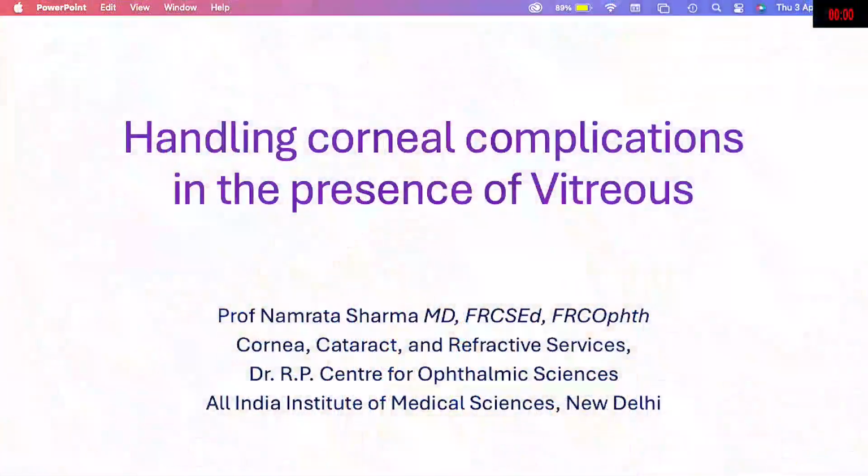So we begin this instruction course on tackling posterior capsule rupture and IOL implantation. And we all know that whenever we have these complications, it is not only the vitreous or the cortical matter or the IOL; there are other complications also associated with that. So we are trying to cover everything in this instruction course as much as possible.